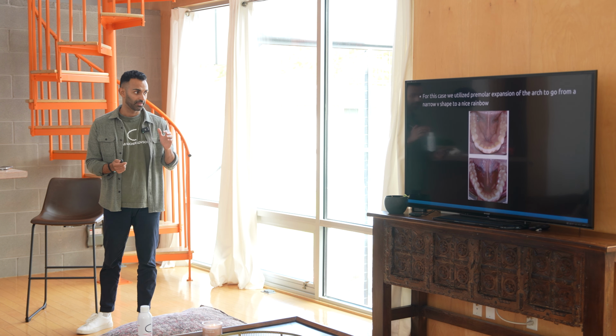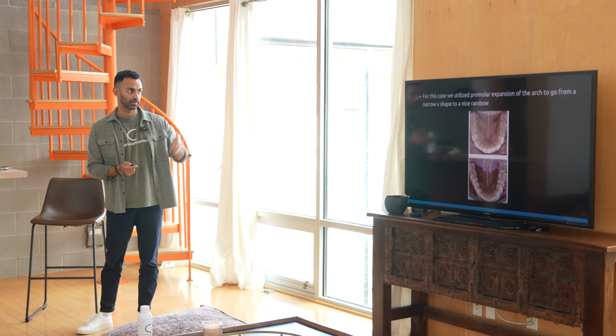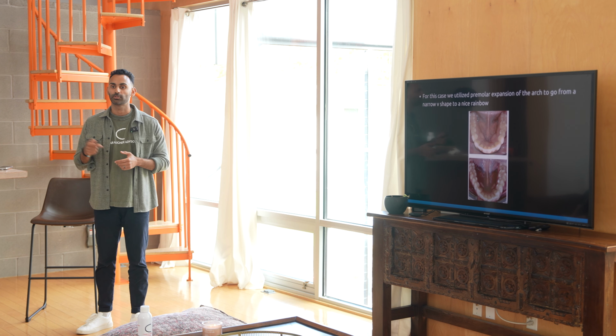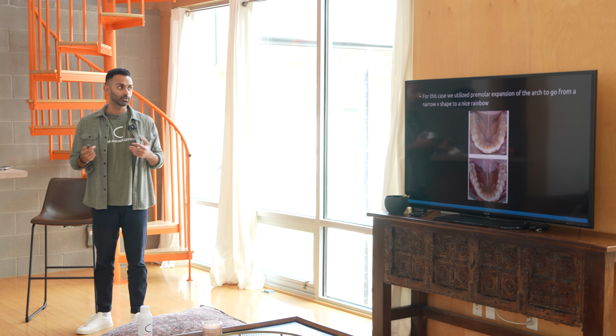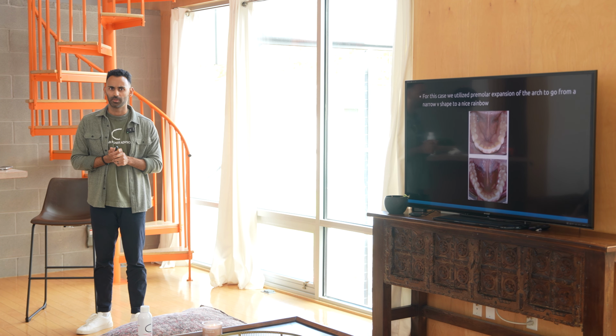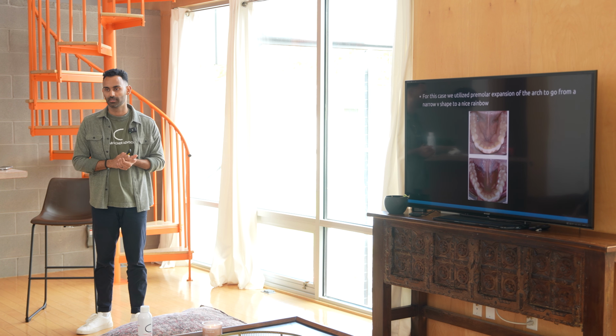And we did it, and then we got a pretty nice result that you see up at the top. I'm like, wow, this is awesome, like everything worked. But when I went over the case with my mentor, they told me, yeah, congrats on the case, but not all your movements expressed. And I was like, oh, what do you mean? She's like, your molars didn't move.